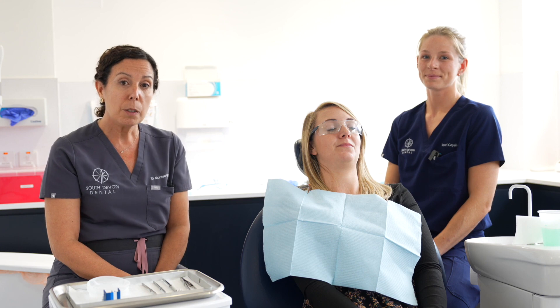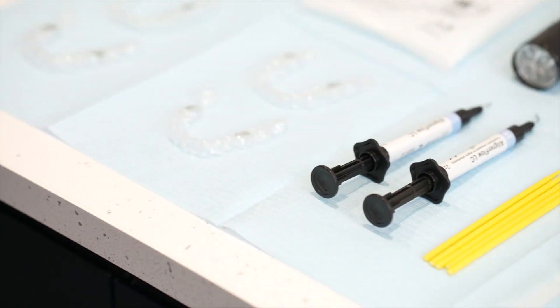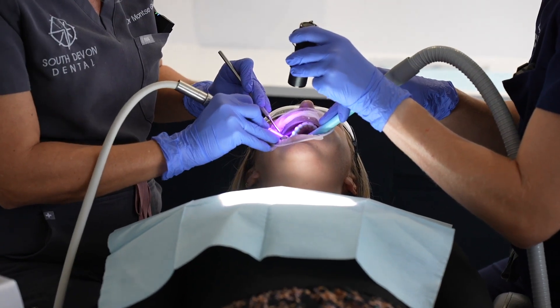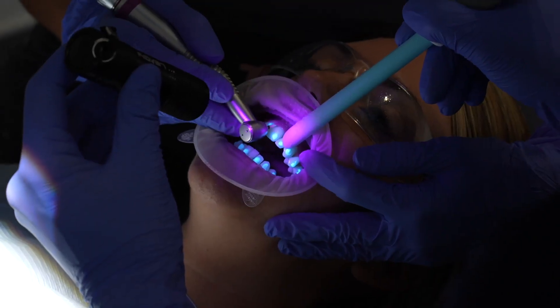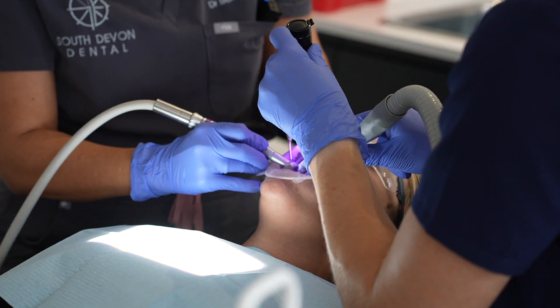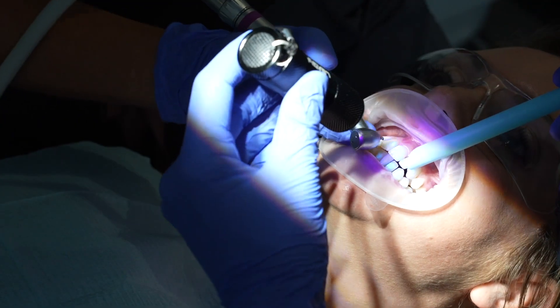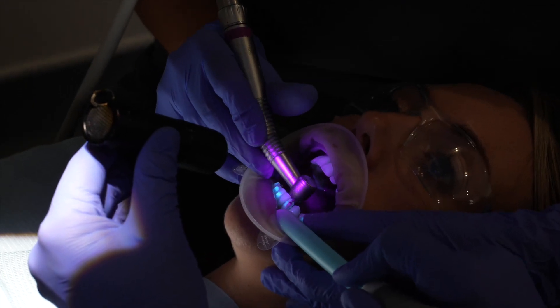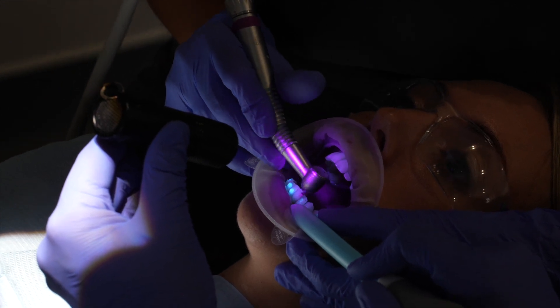With Sami, she's doing misalign treatment. She finished her first set of aligners, we removed the attachments, and we placed the new attachments with Aligner FlowLC from Boko. We'll show you how easy it is to remove those attachments with this composite. Because of the fluorescence, we put a UV light and then we remove all of the composite. We can see clearly where the composite ends and the enamel surface begins, so we don't remove any enamel.